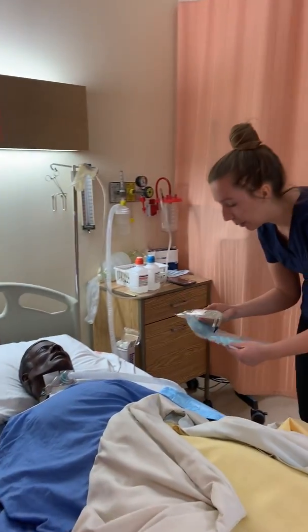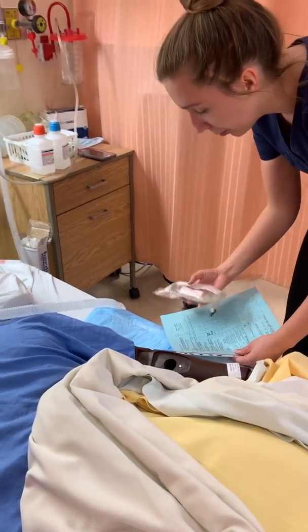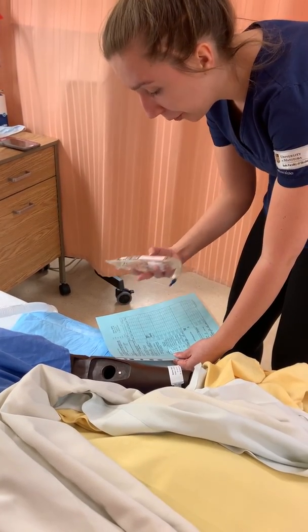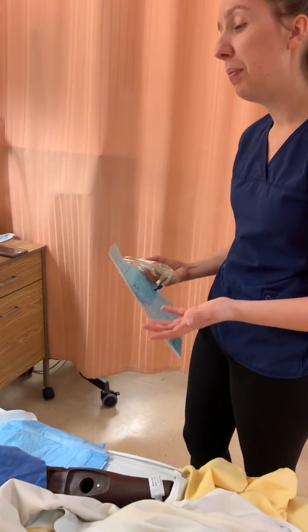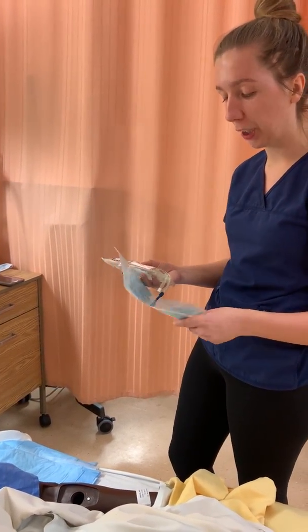So looking at my label, the MAR, and my patient's wristband, I can see I have Wendy Holmes, the correct patient. VIN number 123, 456, 789. Could you tell me your name and your birth date? And do you have any allergies? No, so I know I have the correct patient.